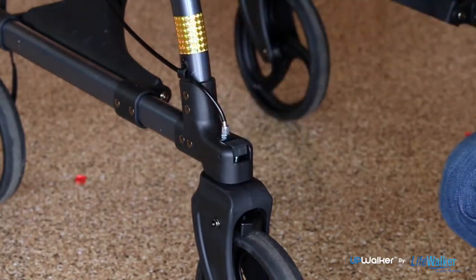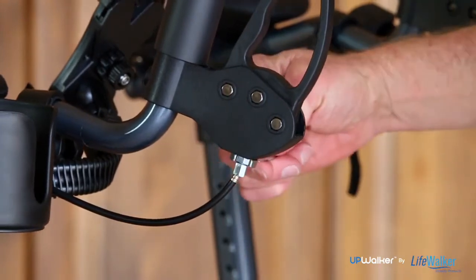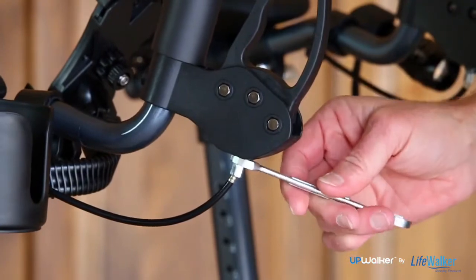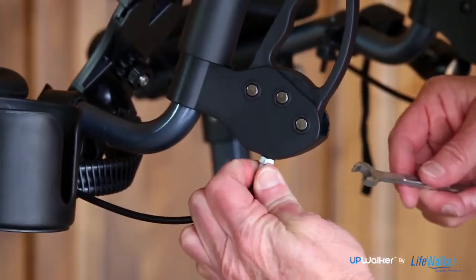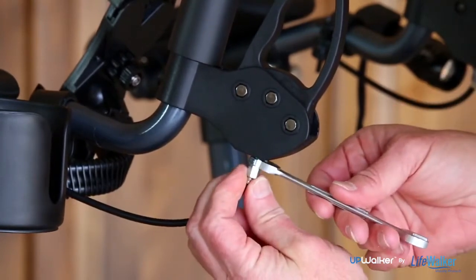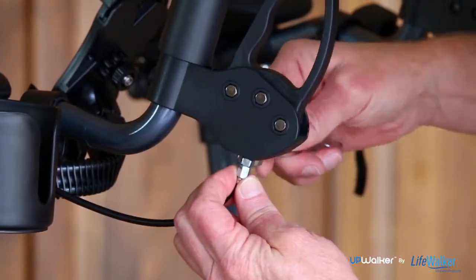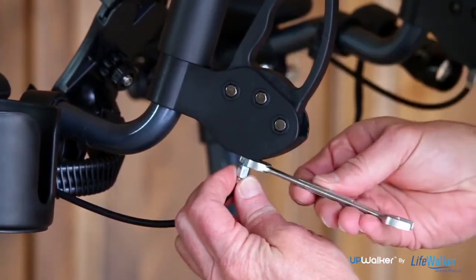Continue to turn the adjustment screw a half rotation at a time until you have adjusted your brakes to the desired tension. Once you are finished, make sure that the larger locking nut is turned clockwise tight against the housing to prevent the screw from loosening. You will use your 10mm wrench on the nut that is closest to the black plastic to tighten and secure the brake.